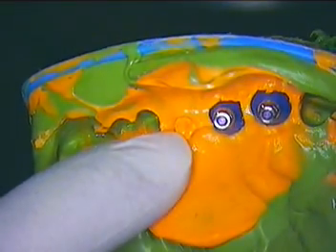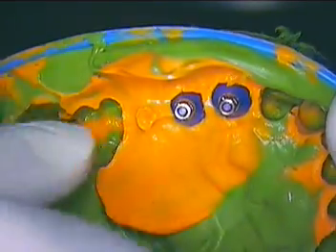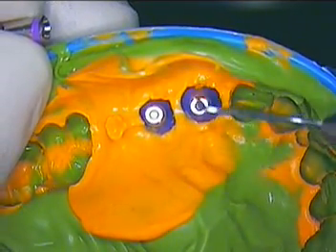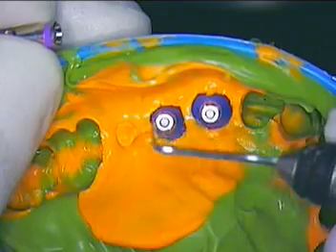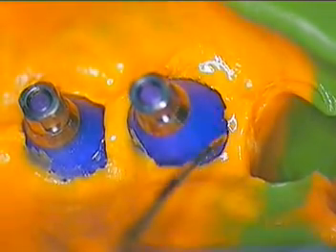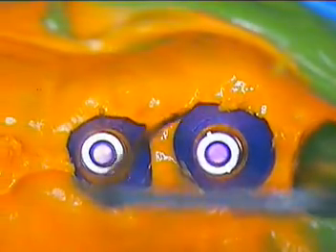13 being the recent extraction pontic area. Now, I'm just showing you the underside of this impression so that you can get an understanding of what we wanted to accomplish at that appointment. Obviously, the blue represents the transfer coping, and we're looking at the underside. You're going to see a very, very nice smooth surface that will give the laboratory technician the necessary space with no undercuts or tissue collapse.